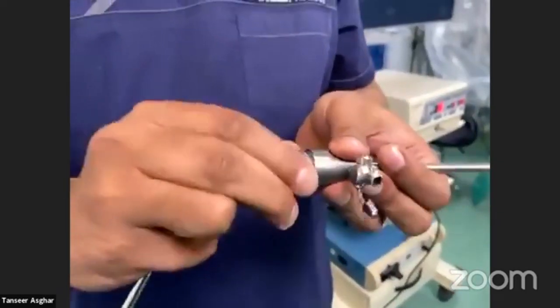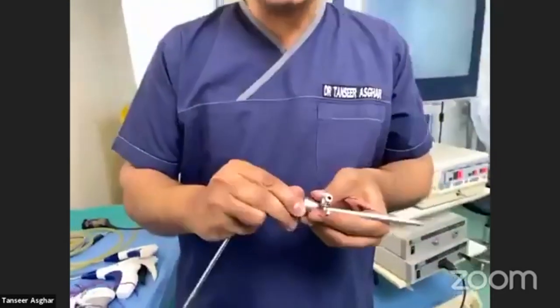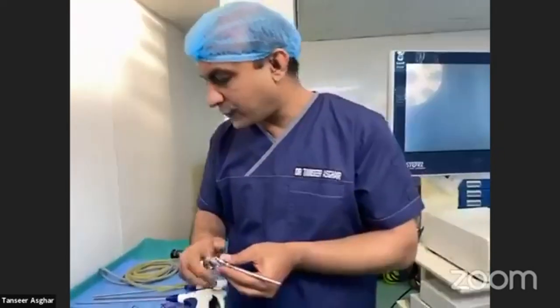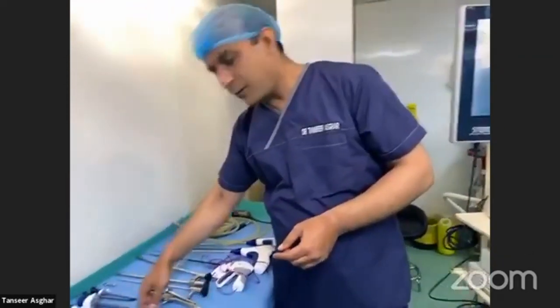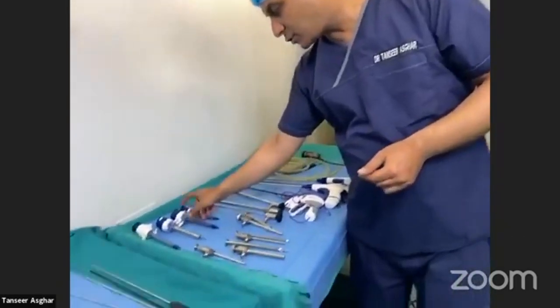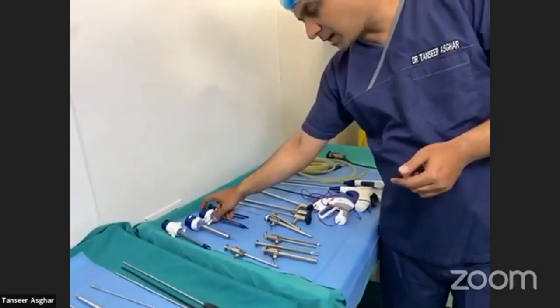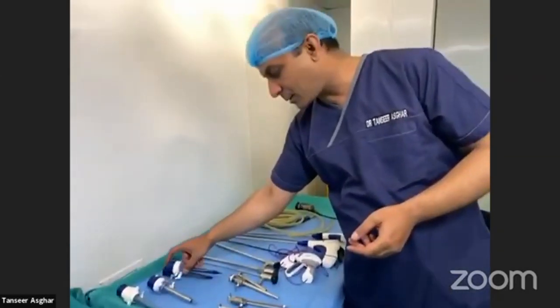There are also three millimeter trocars, which are smaller in length and are usually used in pediatric surgery. The usual length of a trocar is 15 centimeters, but there are also long-length trocars which we use in bariatric procedures and in super-obese patients.